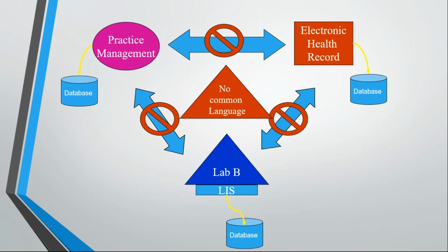And also, we will never know how many people we might have to communicate with. If these are just three people, each of them has to learn two different languages, and they will end up learning both languages and communicating with each other. But just in case, let's say we have 10 people from 10 different countries.